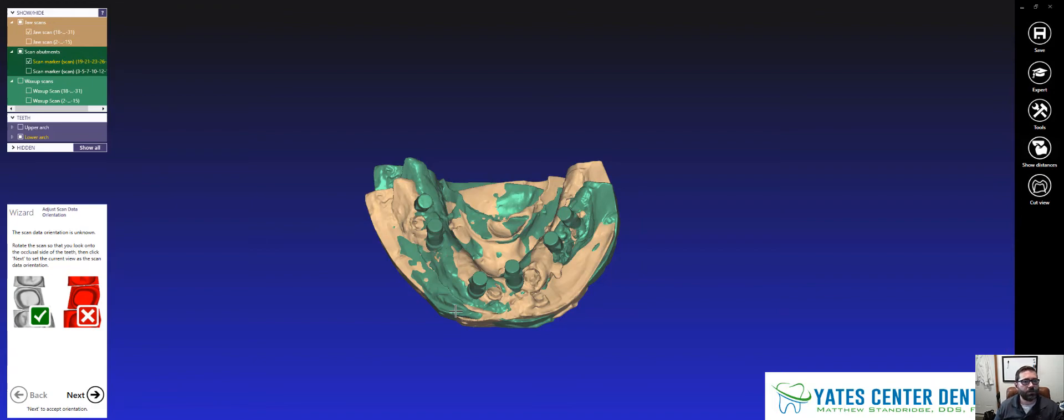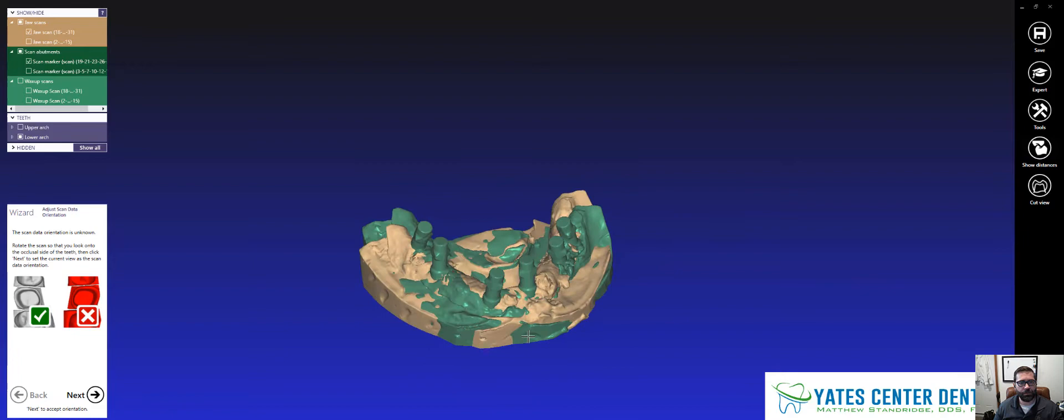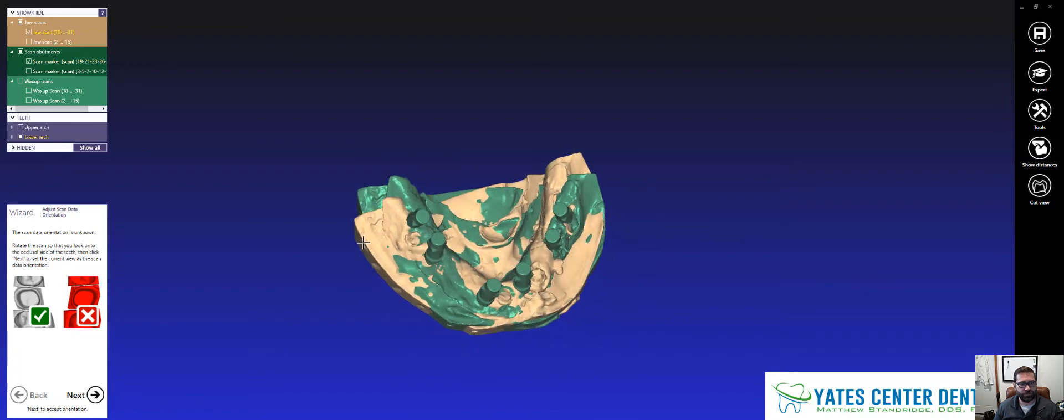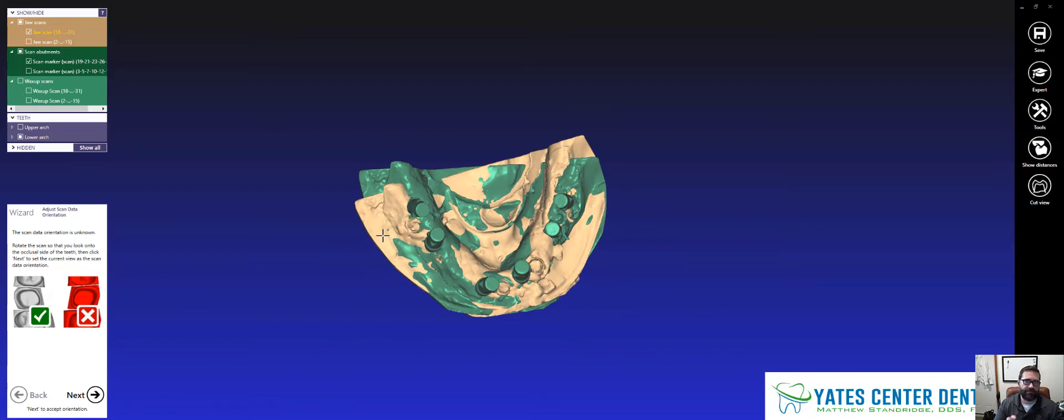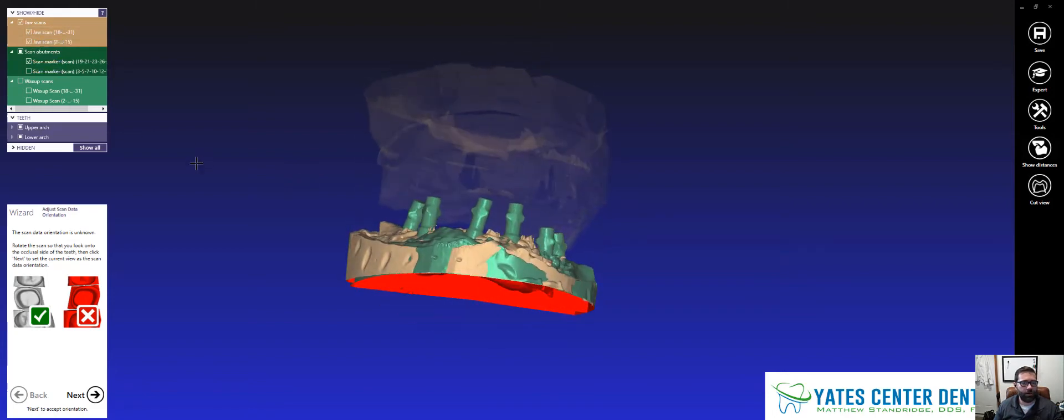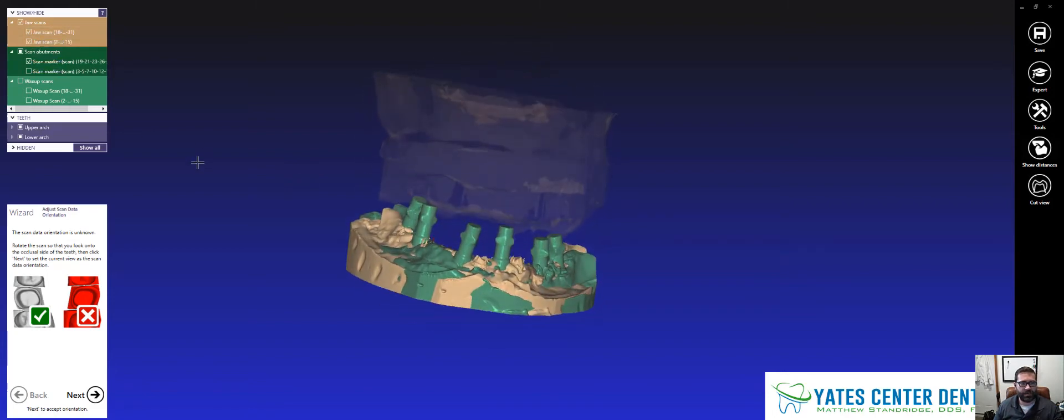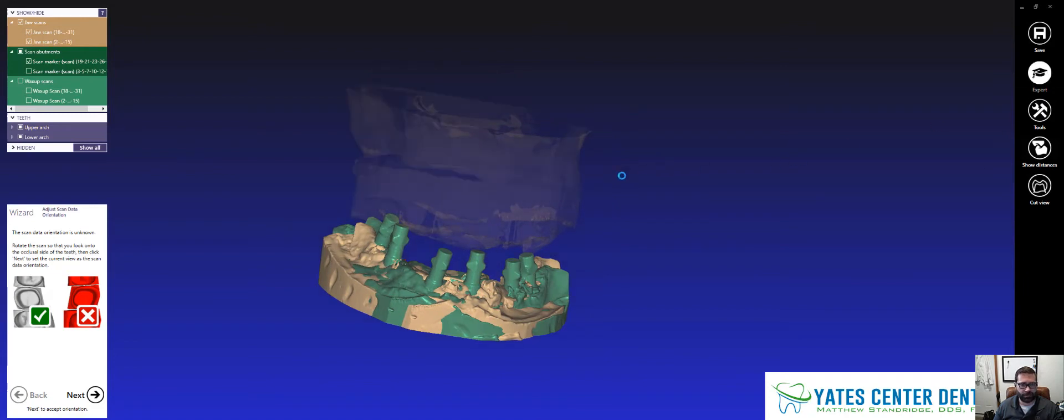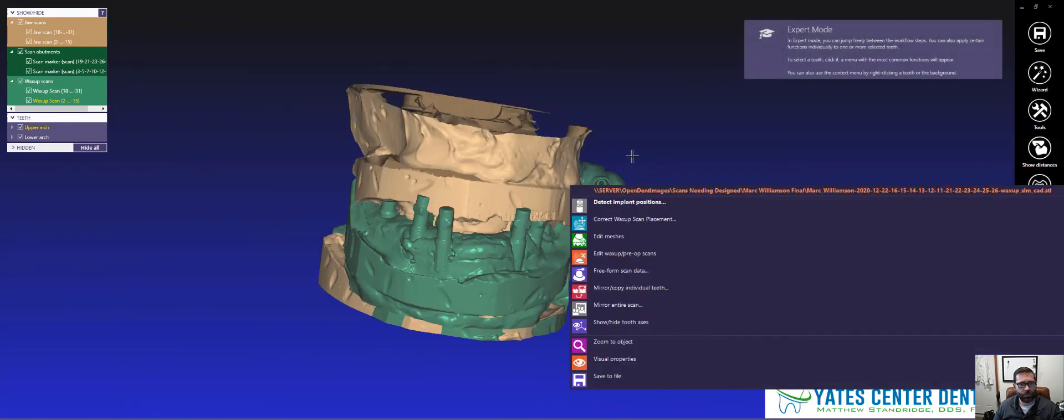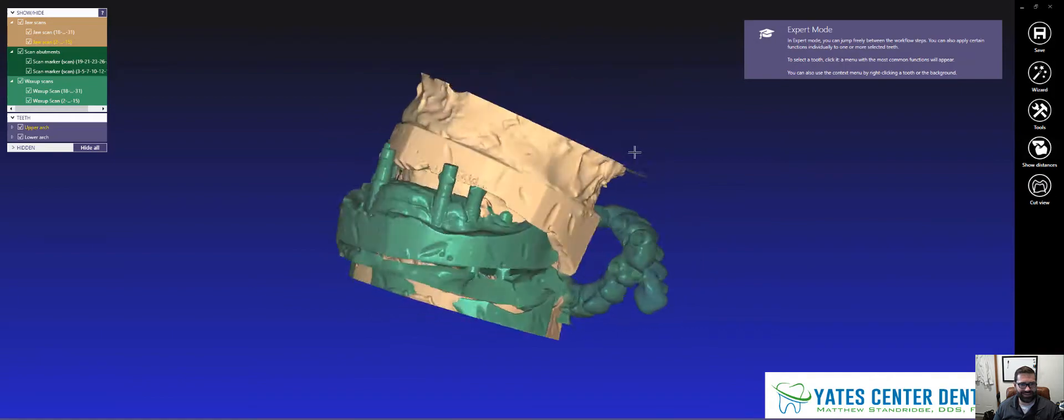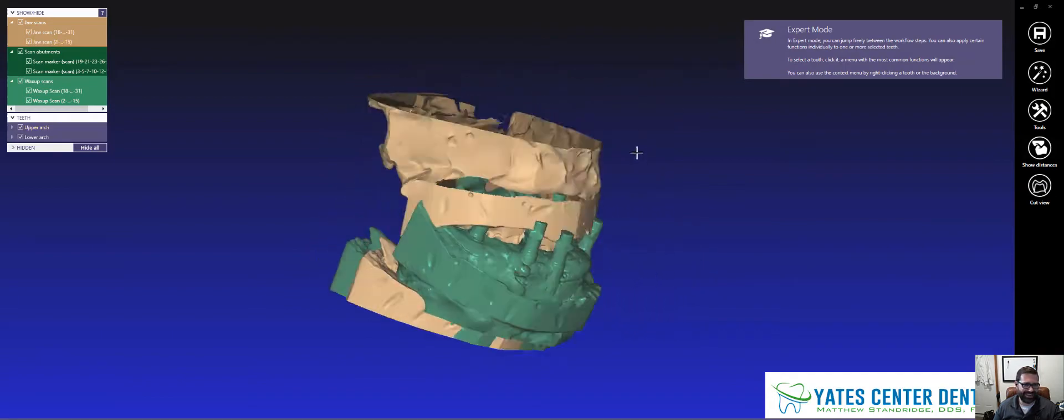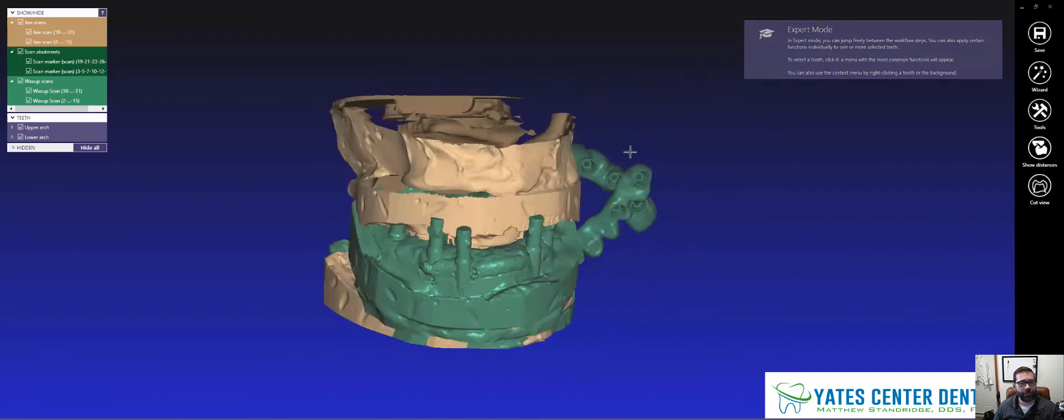So these gingival scans, in this demonstration it's this tan model here, I'm going to use that as my fixed reference points. So I'm going to keep those, both upper and lower, as my fixed points. So I'm going to hop over into expert mode real quick. This shows all of the scan data that I have. It's all over the place, right?